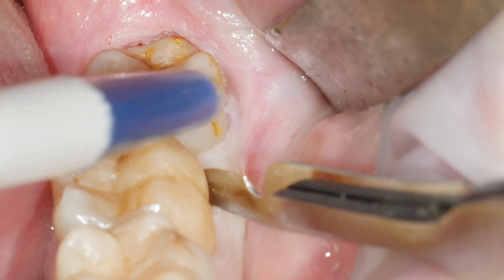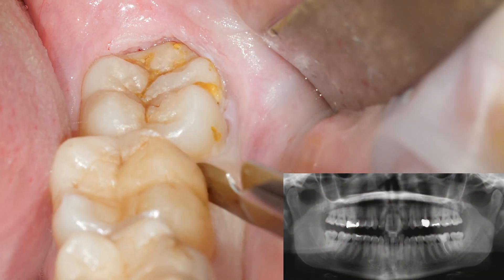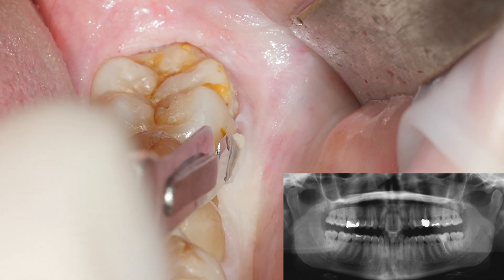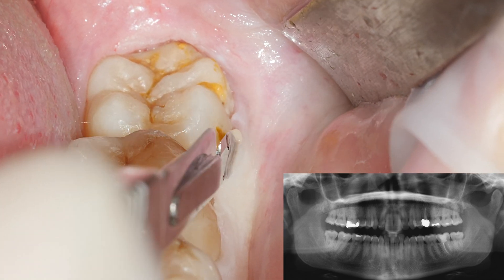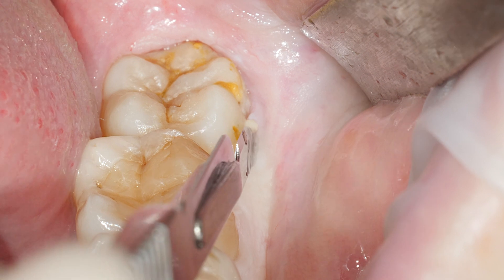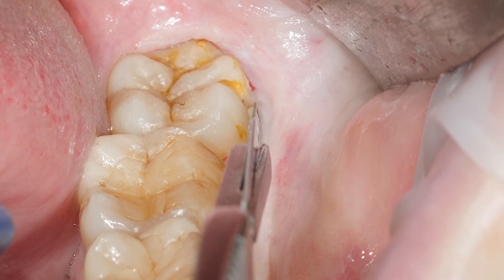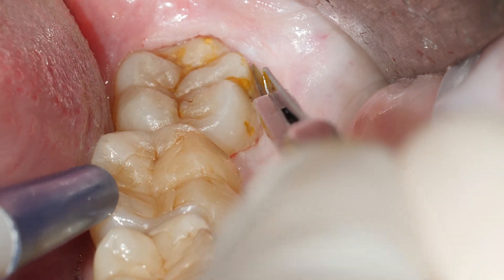We're now working on tooth 3.8. As you can see, it's a biradicular erupted wisdom tooth. The tissues are a little bit inflamed due to the not very nice oral hygiene of the patient.